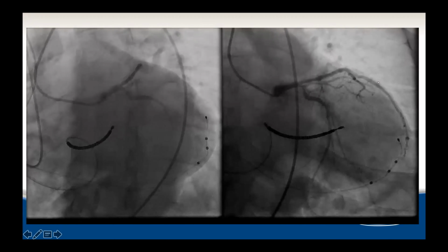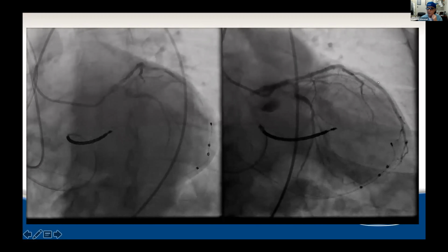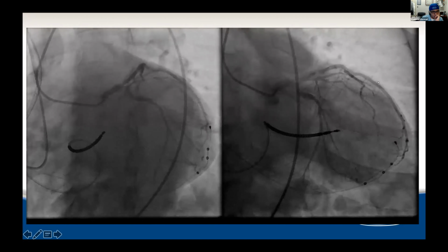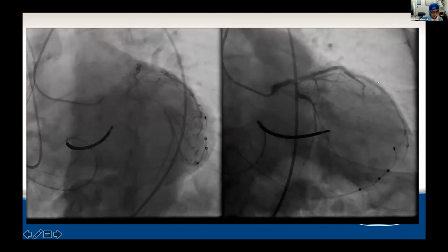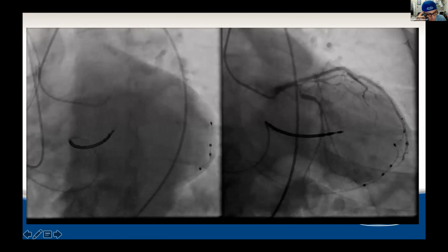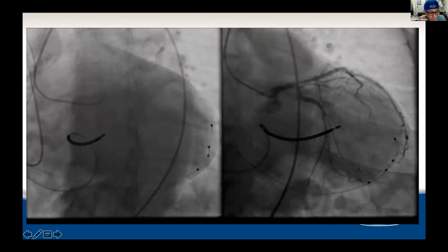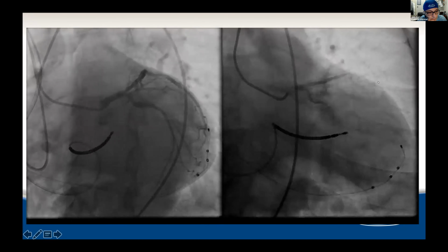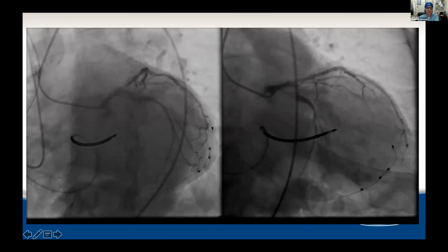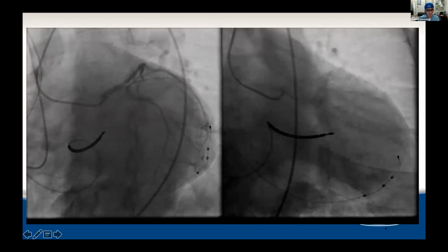So it's just my first 2 cents, but what did you think, Kel? Agree with you. I can't remember what I actually did, but I suspect we're going to need a lot of atherectomy. Sometimes, if I can get away with it, I treat the inflow and get done with it, or treat one vessel, because there is always another day to come back and fight. I'm not sure what we've done in this case. So Kathryn, can you tell us how we approach this?